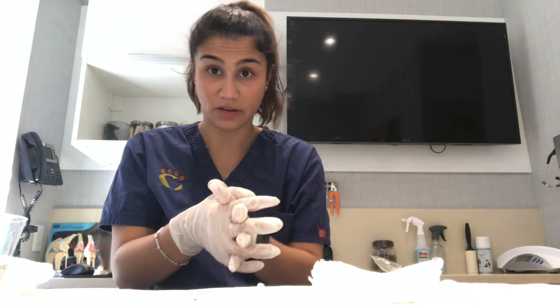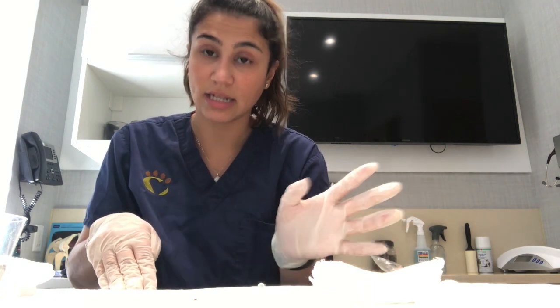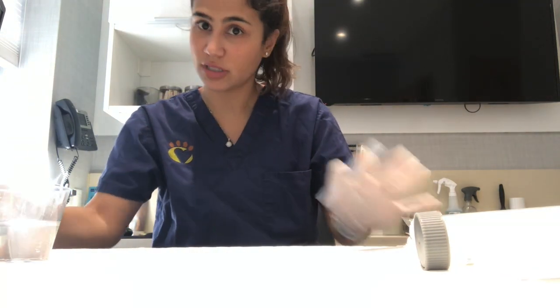The main difference between a fecal flotation and a fecal flotation with centrifugation is that the fecal flotation with centrifugation is actually much more sensitive than the simple flotation. It recovers many more cysts and eggs in a shorter amount of time. Okay, the next test I will be doing is a fecal flotation with centrifugation. It's pretty much the same steps as just a fecal float.